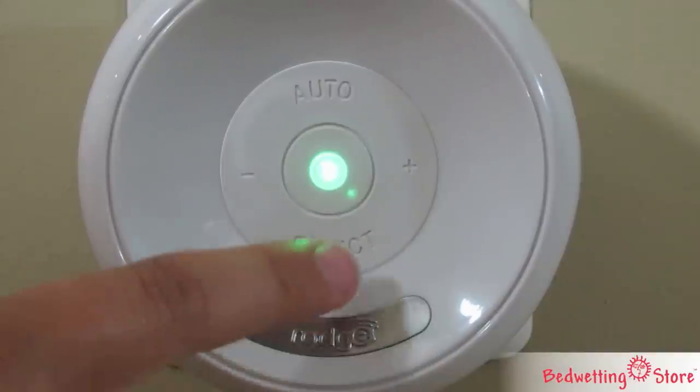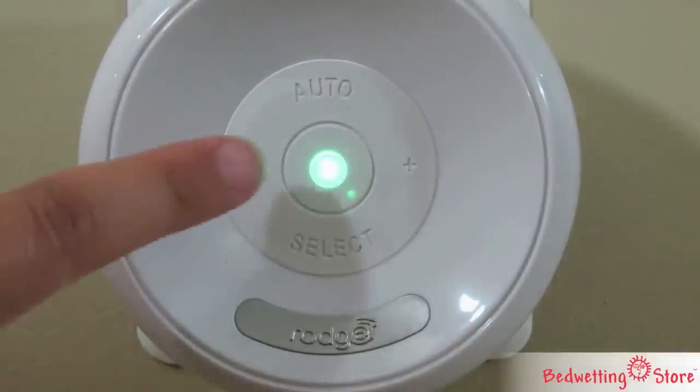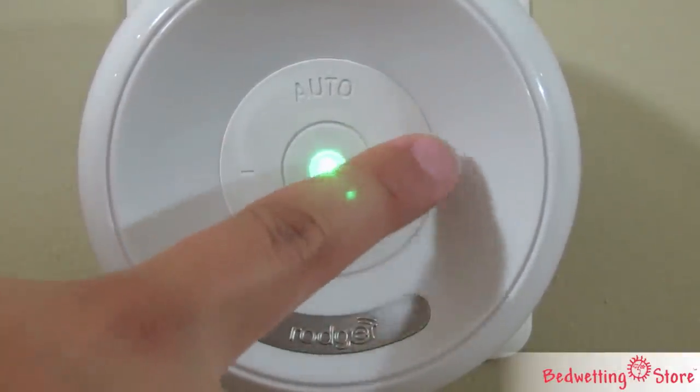You can select one of eight different tones or set it up to random. To adjust the volume, press the plus or minus button repeatedly. Don't hold down either button or attempt to adjust while the alarm is sounding.